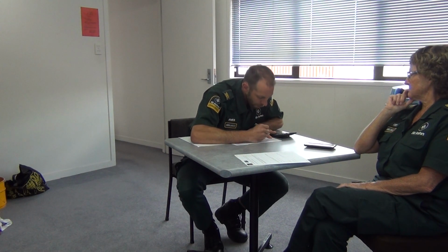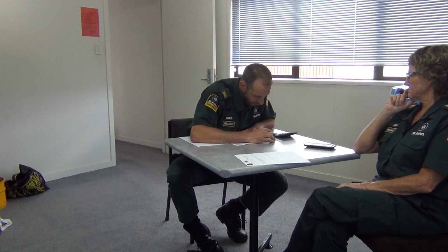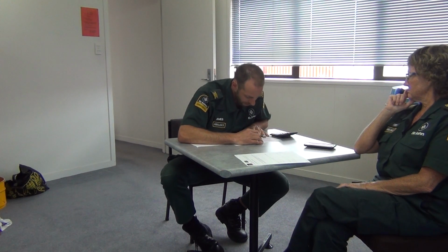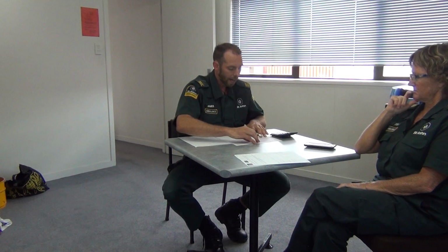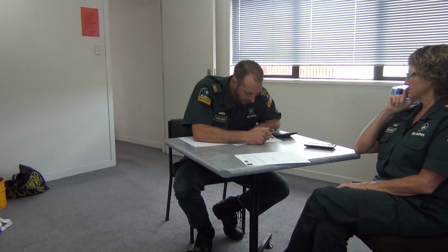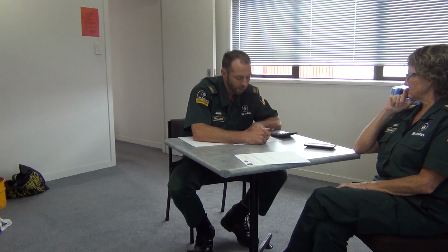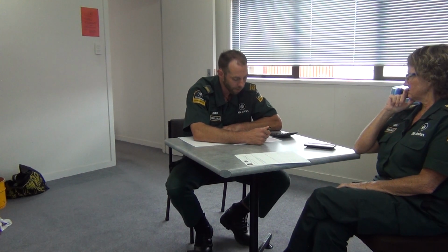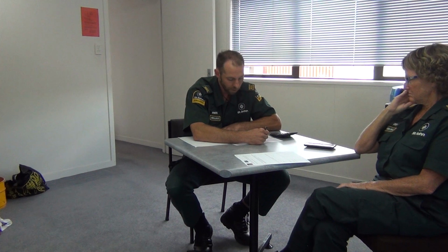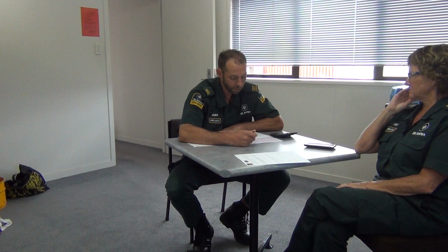So in lead 2 it is 2 mil, in lead 3 it's 2 mil as well, and then in AVF it's 2 as well. And in the high lateral leads of AVL we've got probably, I'm going to say, 0.5 millimetres of depression, so that tells me that there's some reciprocal changes. We have got some ischemic signs in the septal leads.